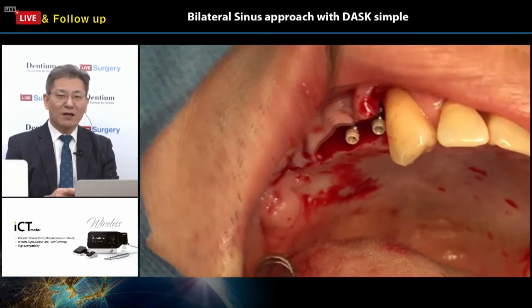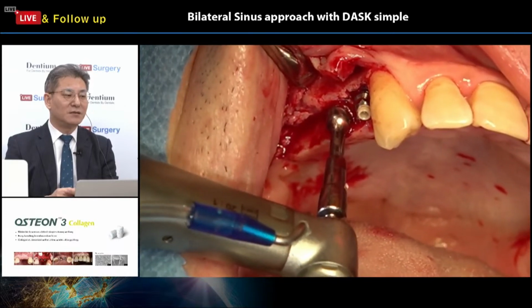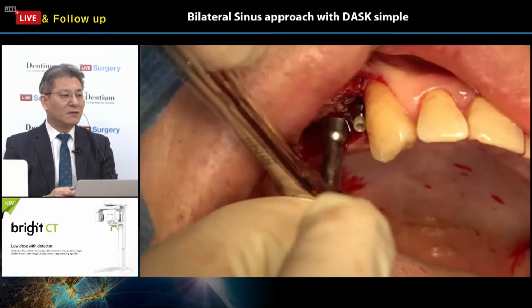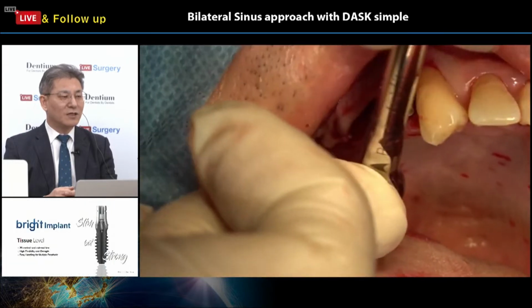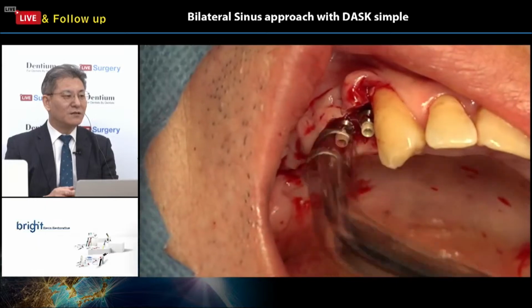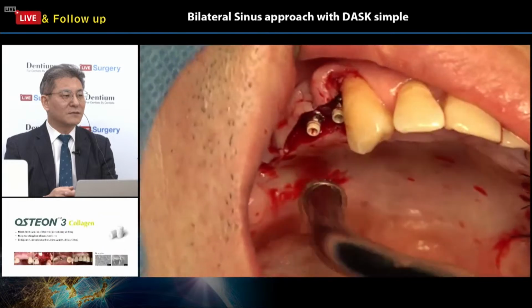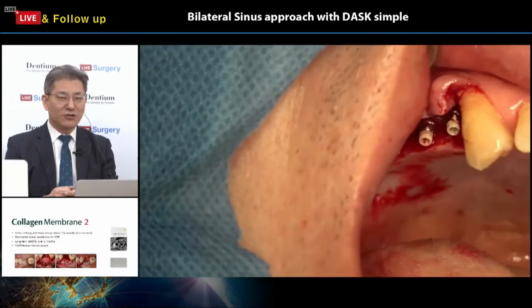This unique design makes us much more comfortable to do the final prosthesis. Okay. Oh yeah, too strong at tugging into the bone. So Dr. Chung is doing the reverse screwing. Yeah. The very high insertion torque is achieved.